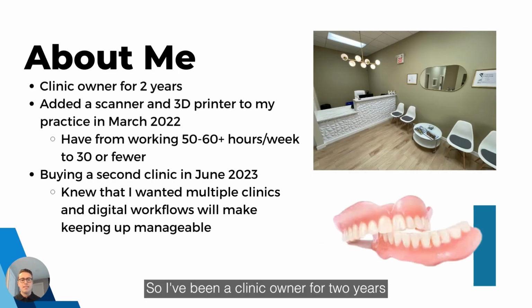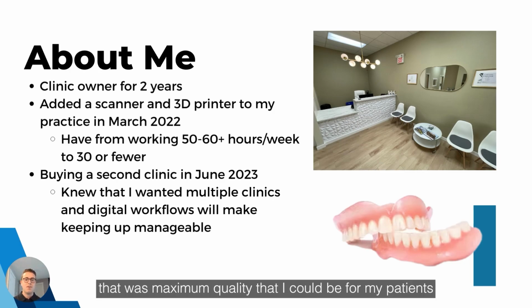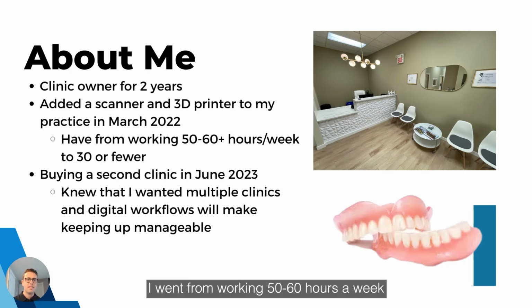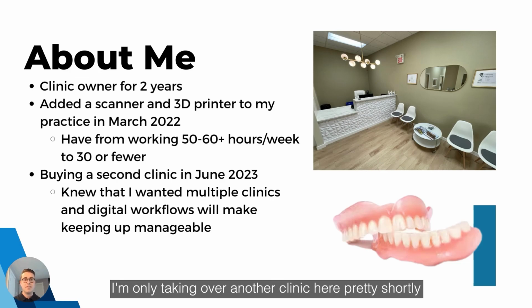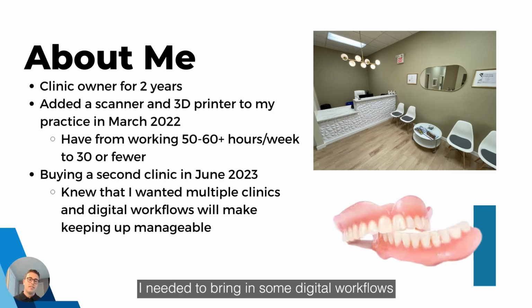So I've been a clinic owner for 2 years, and it wasn't long into that I decided I needed to go digital, just to save my own back, but also to start producing something that was the maximum quality that it could be for my patients. I went from working 50, 60 hours a week down to 30 or even fewer sometimes. I'm going to be taking over another clinic here pretty shortly. And I knew that if I wanted multiple clinics, which a lot of denturists do, I needed to bring in some digital workflows to make my workload manageable.